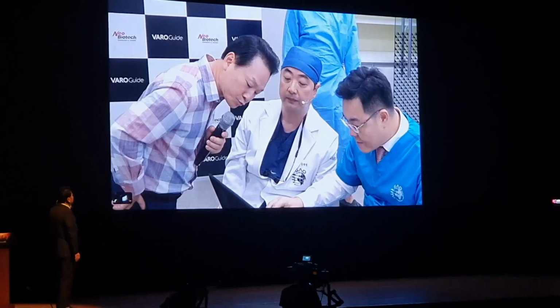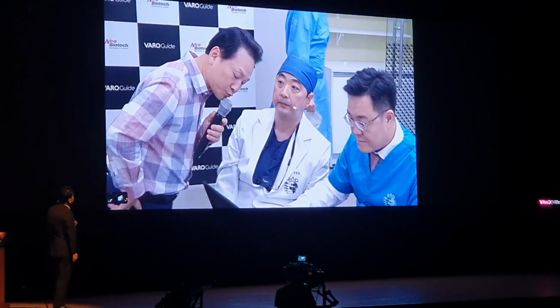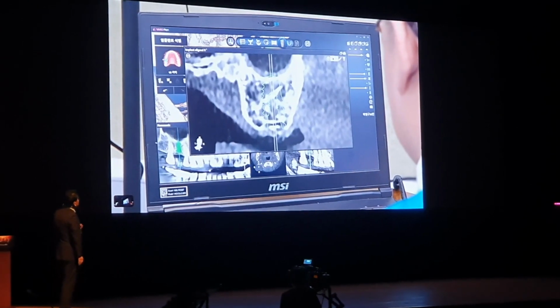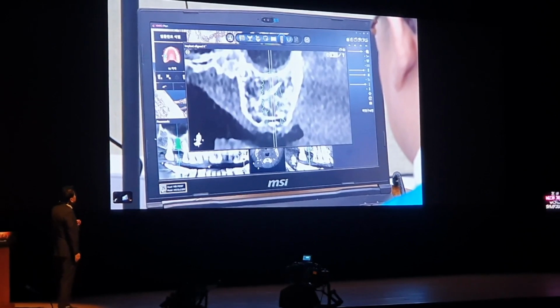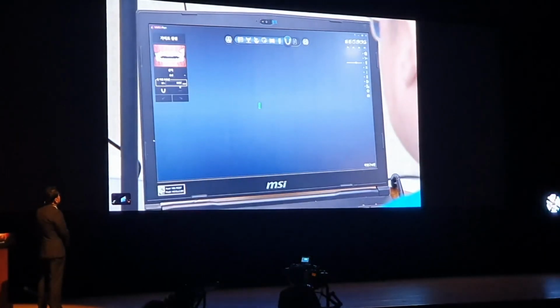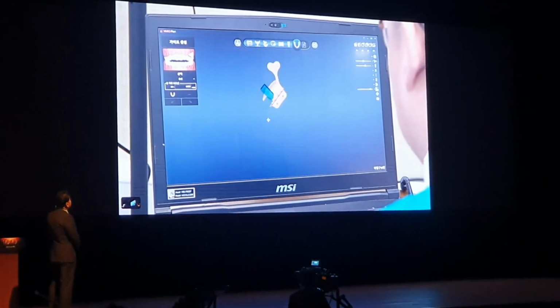So Dr. Kim, is the case SAC classification CMI 2 or 3? So residual bone height is about 9 mm. With a little bone graft, I think class 3 will be appropriate. Well, with 9 mm of residual bone, we can obtain CMI classification 2 or 3, but the patient first demanded a different implant size. Now he asked to perform bone graft as well, so I'll do it as a CMI classification 3.